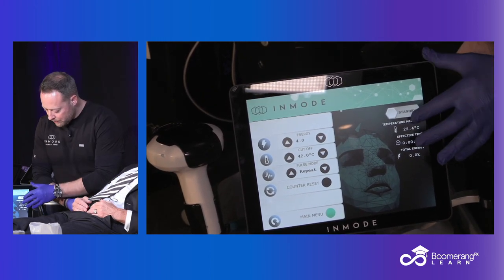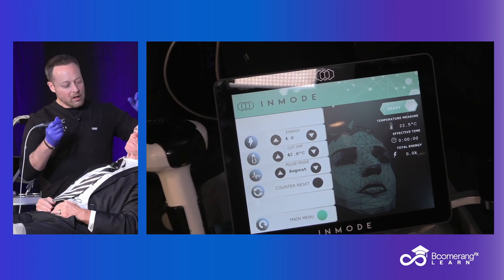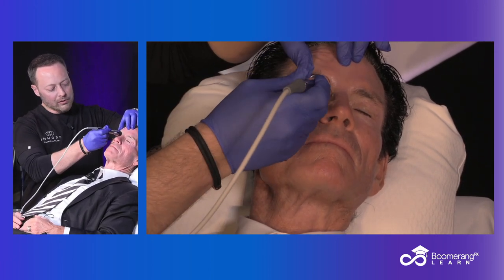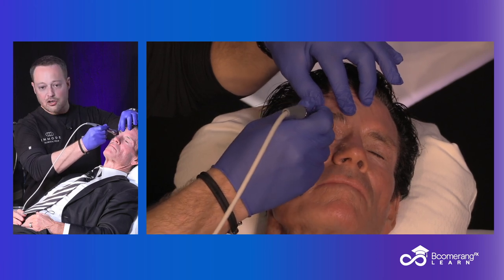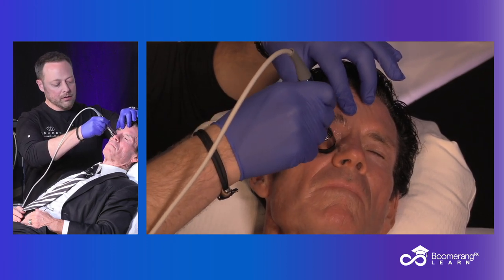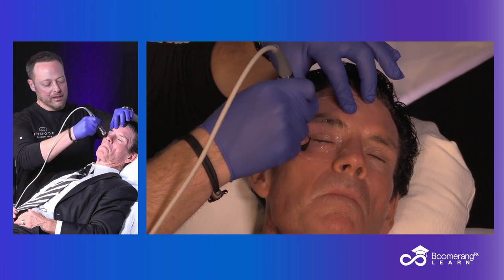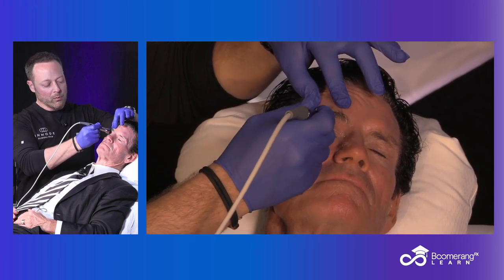For new offices, we like to start off at a little bit lower RF power. What that allows you to do as a provider is move slower and hone in on your technique, since we're right over the eye itself. Everything on the screen is set, then I'll apply — first making contact with the probe, then I'll depress the pedal. The audible tone lets me know it's delivering energy. That double beep means we're approaching the cutoff temperature, and a triple beep means we're reaching that cutoff temperature of 42 degrees Celsius. Then it's just alternating between the upper and lower, maintaining that tissue temperature.